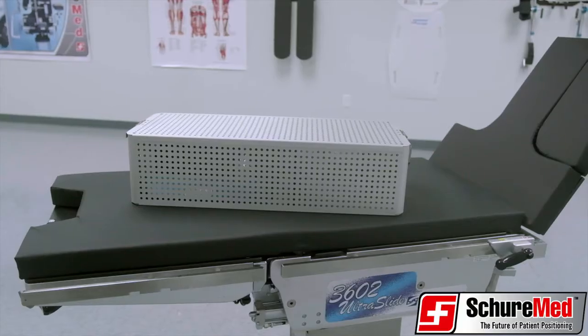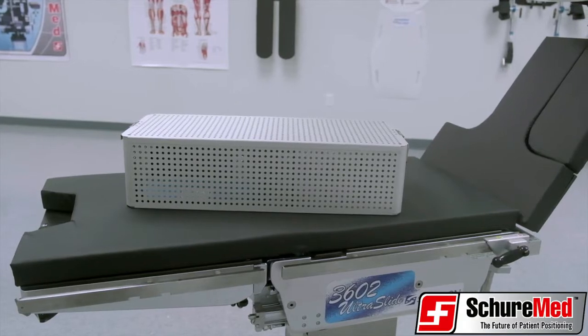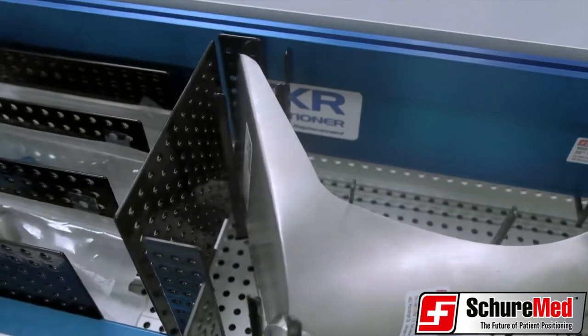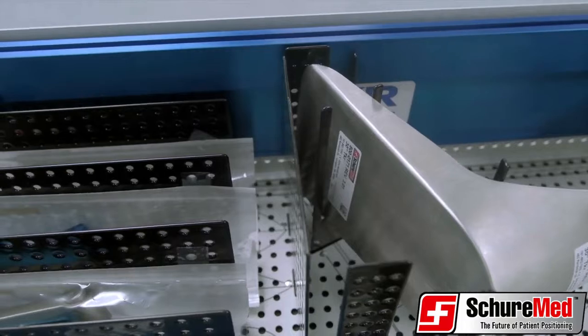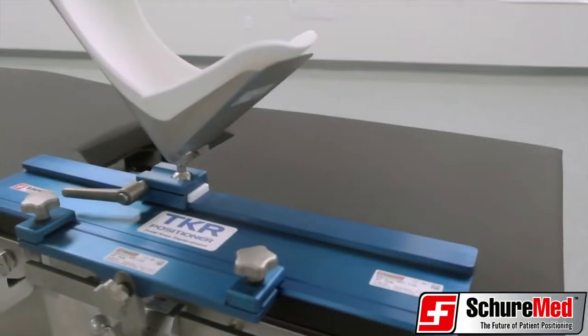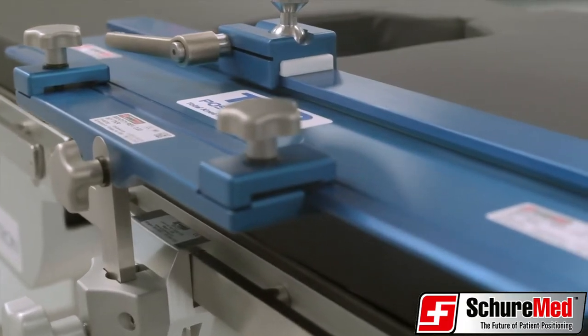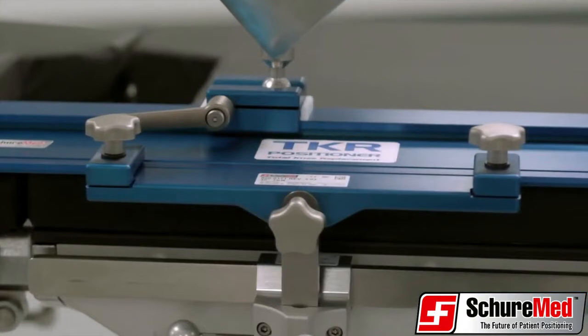Today, we are highlighting SureMed's intuitive and easy-to-use TKR for total knee replacement. The TKR system is an innovative surgical knee positioner that is fully adjustable, completely secure, and autoclavable.